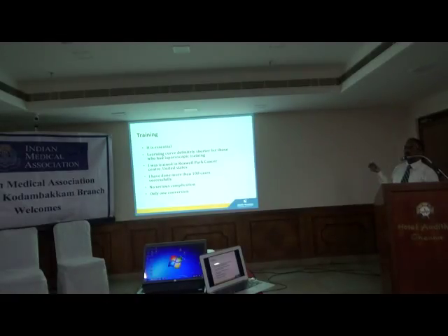For those who have extensive open or laparoscopic training, getting into the robot and starting work is much easier. The only thing in robotics is you have to scale the movements because you don't have tactile sensation. That is the biggest thing. I got trained in the US for a few days and I've done more than 100 cases.